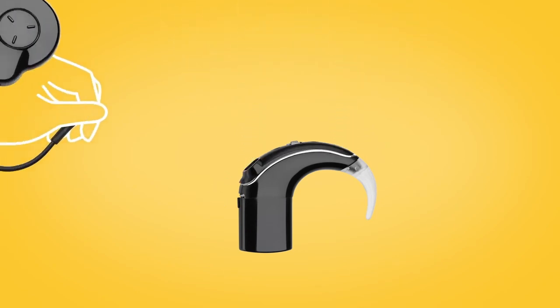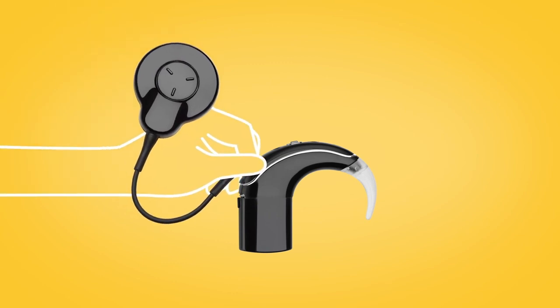Lastly, without twisting, push your coil cable onto the sound processor until it clicks.